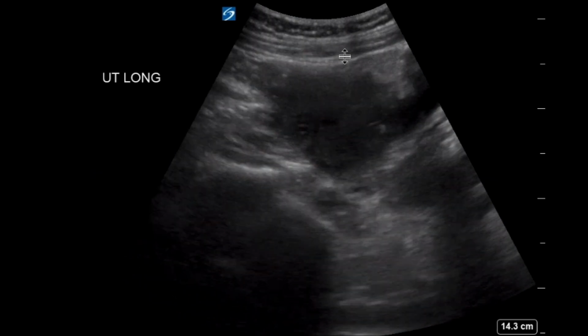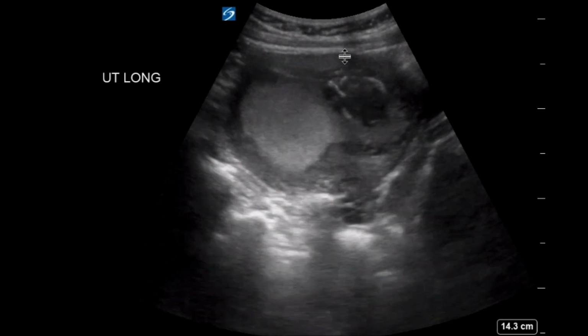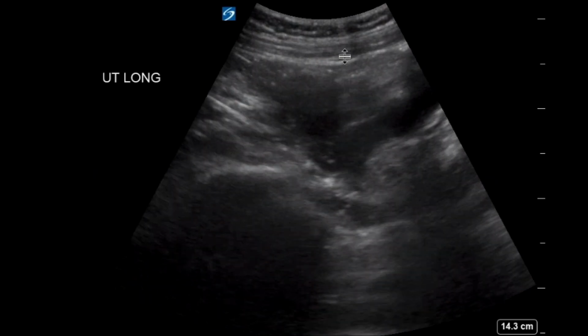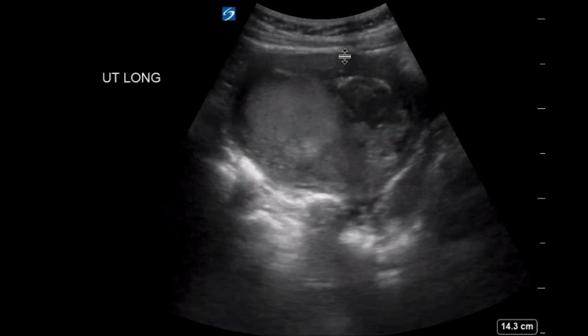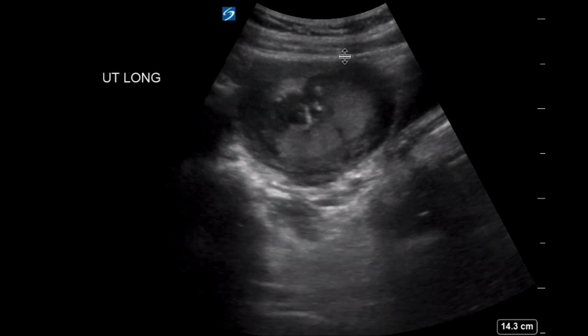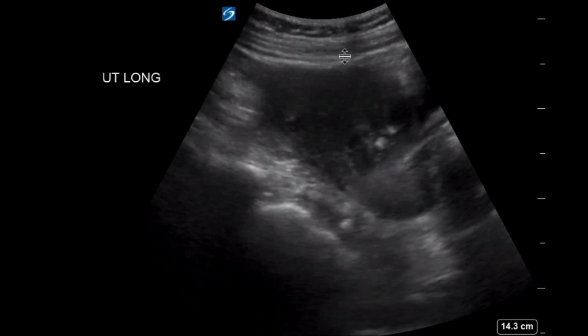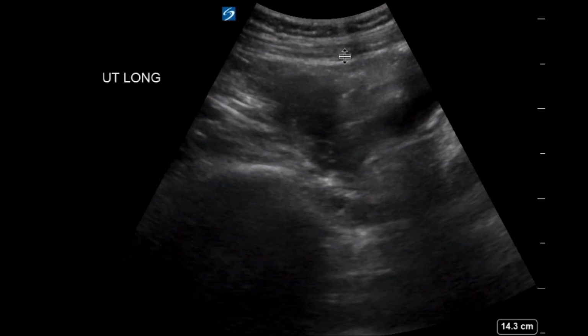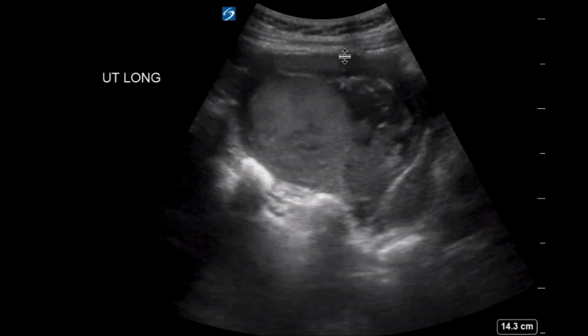I believe that's a second and third trimester tool. So here it really wouldn't apply. Right, there's nothing to measure here, but also it's not validated in first trimester. It's really only after 16 weeks or so when you can start using the MVP measurement to look for and rate oligohydramnios and polyhydramnios and things like that.